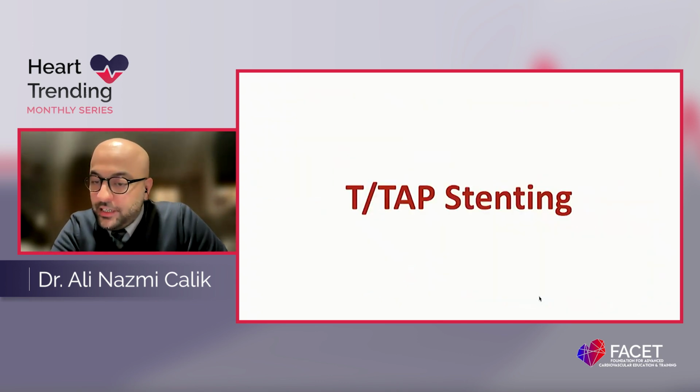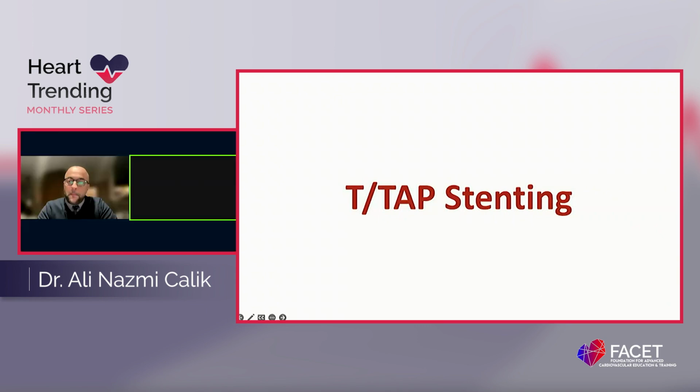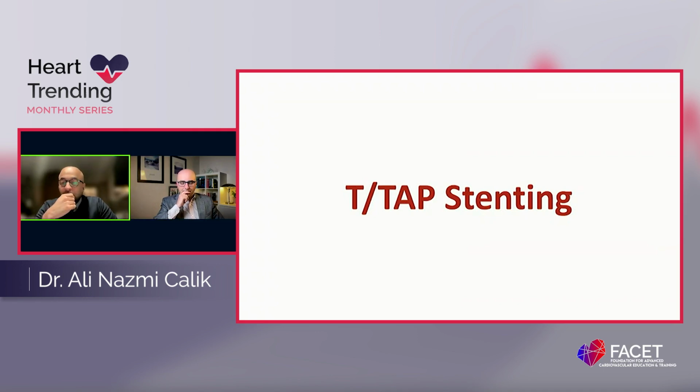So if you have any question at this point, or no, it's perfect. I mean, this is a beautiful illustration, especially with the last case. Ali, you illustrated nicely: don't underestimate these, especially with somebody with ACS, maybe it's a thrombotic lesion, and always there's thrombus or plaque shift that can compromise that large circumflex. Completely right, Chadi. Completely right.